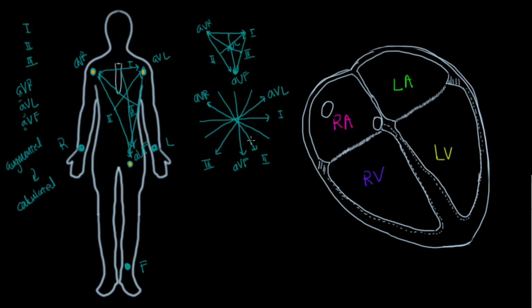AVF. Now the direction of the arrows here indicates where our sensors would be in our example that we used before, the tubes and sensors. So our vectors here are our tubes, and these yellow dots, as we've always been using, are our sensors. And what you may notice, this is a technical thing that you don't need to remember, but just for your understanding, these are all 30 degrees apart. Another 30, another 30. See, now this is the right angle, 90 degrees. So we're able to detect things in 30-degree increments, which is pretty precise, I would say.